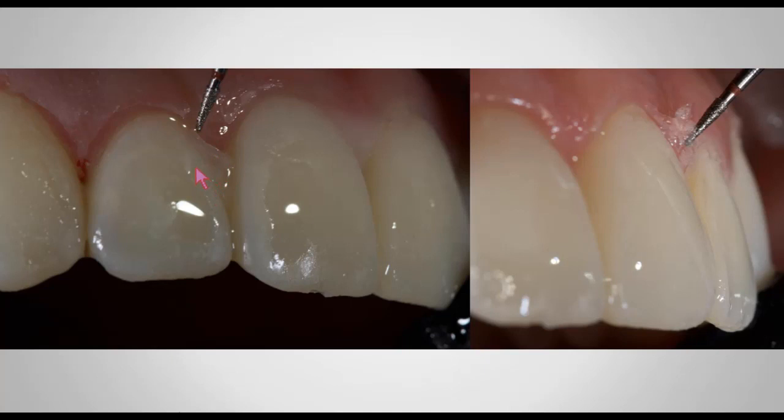I just want to make sure that the patient is able to get a soft pick, which is a very tiny interproximal toothbrush, and the tip is made out of very soft rubber, and it's very, very thin. So all I want is for that soft pick to go in between the embrasure area. So I leave a fairly thick connector, but they will be able to clean in between each tooth using those little soft picks.